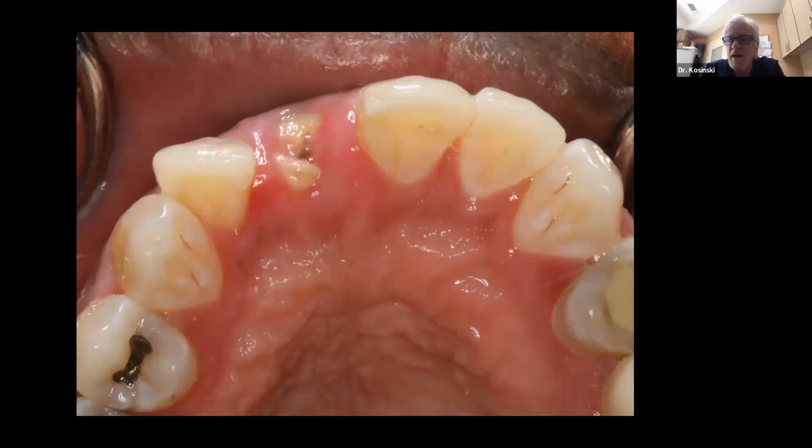Then I challenge that many of us would probably take some type of anterior forceps, grab onto the tooth, squeeze as hard as we could, and do our figure 8 or mesial distal or buccal lingual motion to try to get that tooth out. When that happens, we often get trauma to the facial plate of bone, which can complicate the situation.